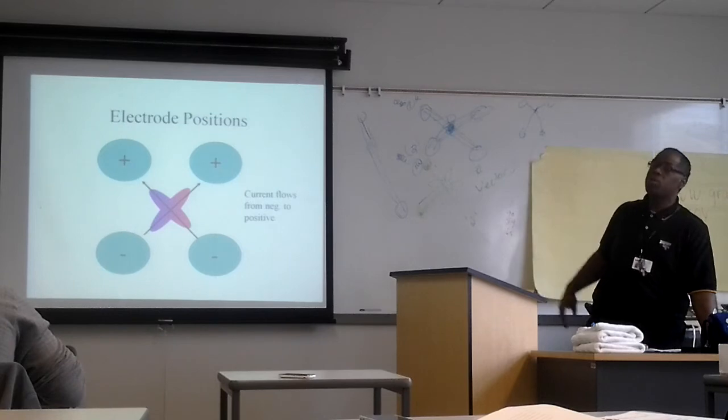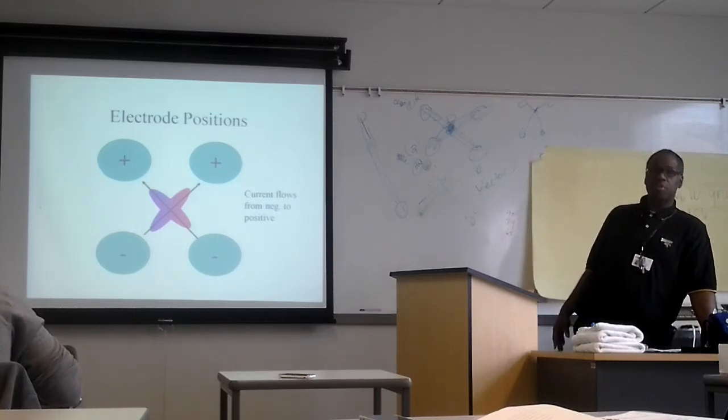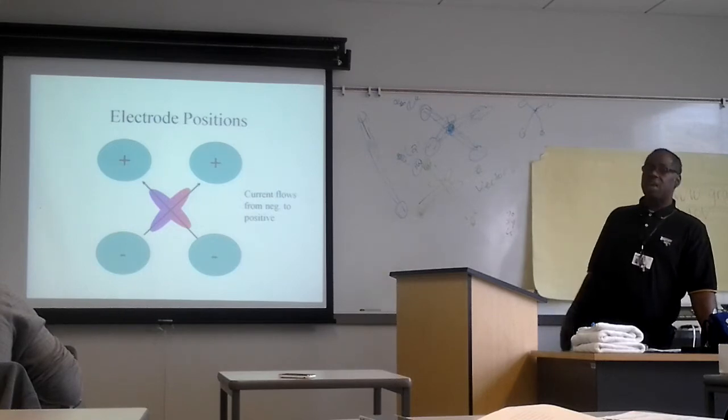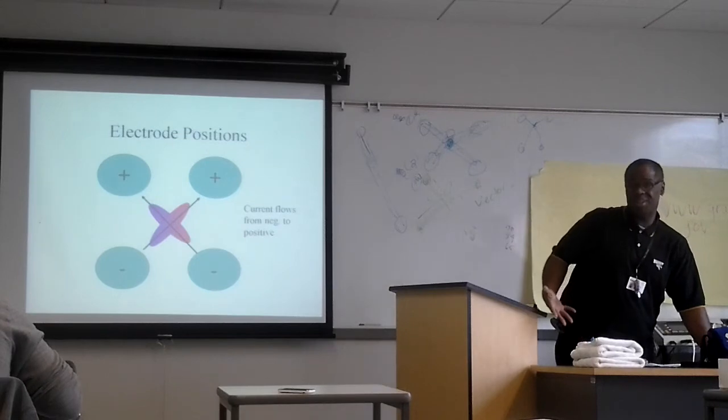That's why, most of the time, when we get pain protocols that are deep, it's best to use interferential as opposed to just a straight biphasic machine. If you want it superficial, then it's okay. That'll be good for superficial. But if you're trying to get something deep, it'll be best to have an interferential unit. Otherwise, it's not going to really go down there effectively.